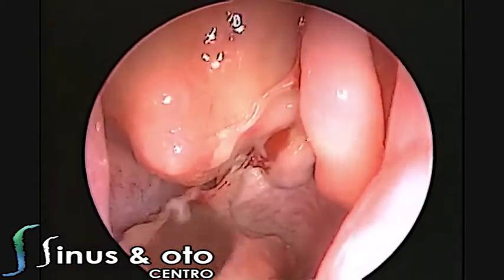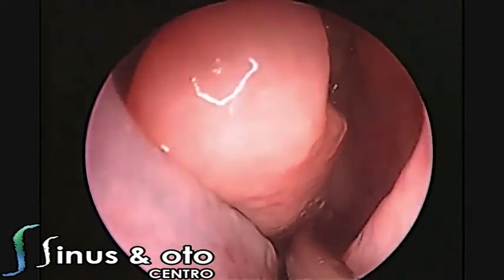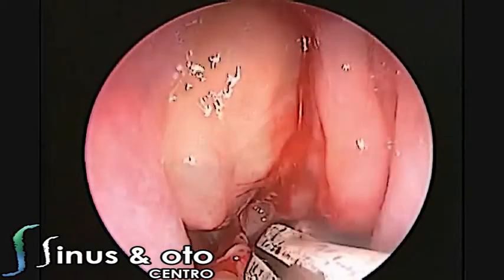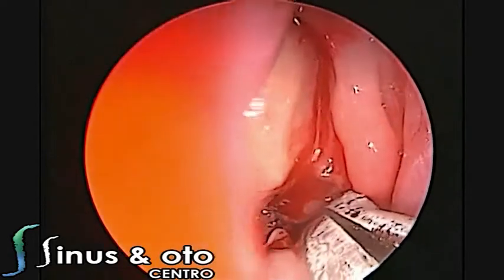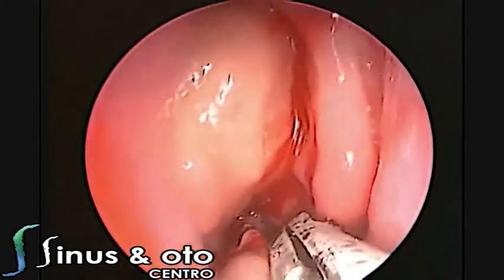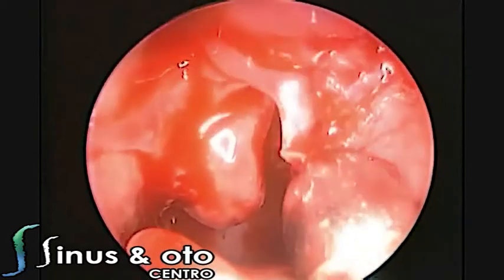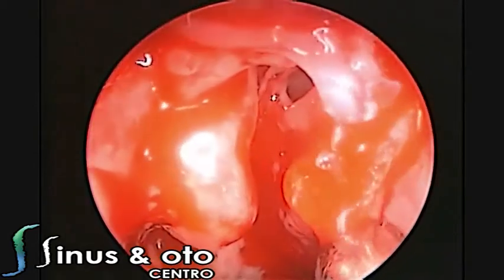That is the ethmoid bulla over there, right below the lesion, and this is the middle turbinate. We are opening the maxillary sinus using the M-line — the horizontal line that lies below the ethmoid bulla.